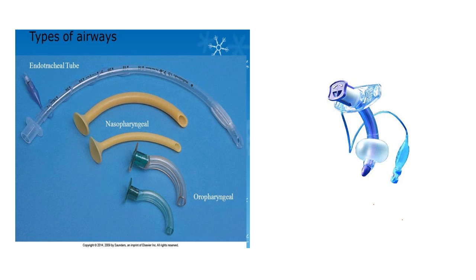And this is called the oropharyngeal airway. We put it through the mouth, okay? And we put this when the patient is having a tongue fall and is finding difficulty to breathe, to ventilate. Putting this might help the patient to breathe or ventilate. And also when we go for intubations, when we give sedations, most of the patients have tongue fall, and when we put this airway, we can easily ventilate the patients. These are of different sizes, like 2, 3, 4, and accordingly we can measure the size which we can use.